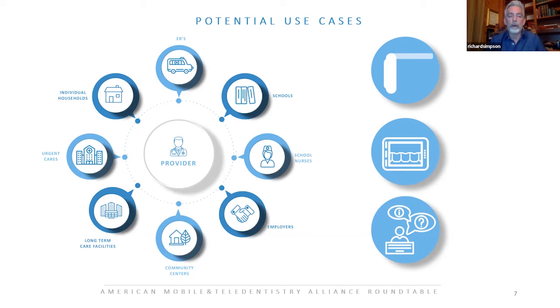We are seeing an increased desire and usage in public health services and doing school screenings and school risk assessments, and then working with community dental hygienists. And as he mentioned earlier, there's quite a few people across the country now that are realizing that there is an entire market and unmet need in assisted living facilities and nursing homes.